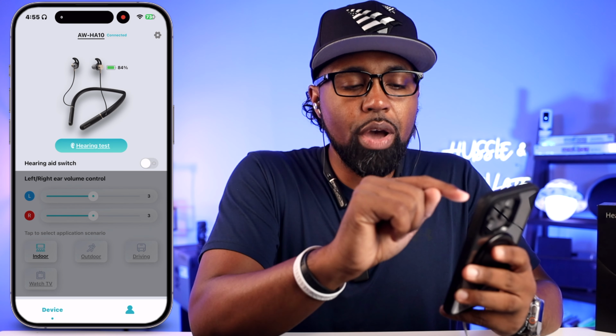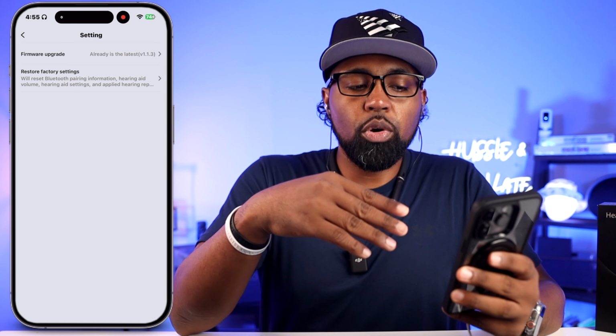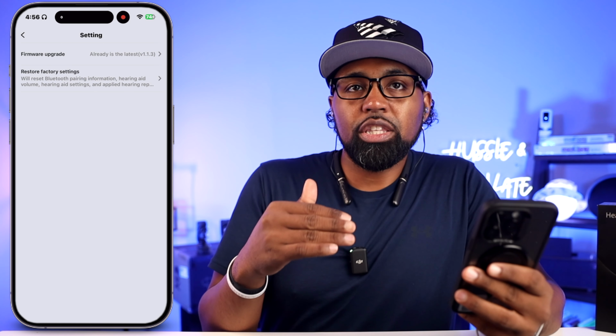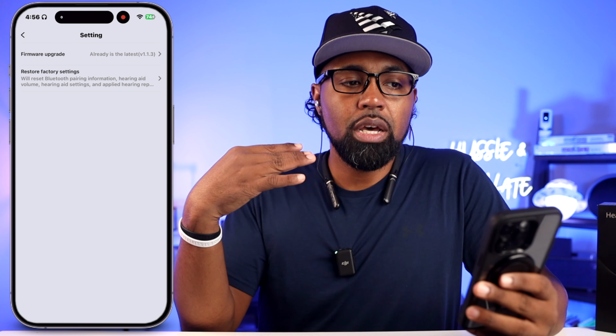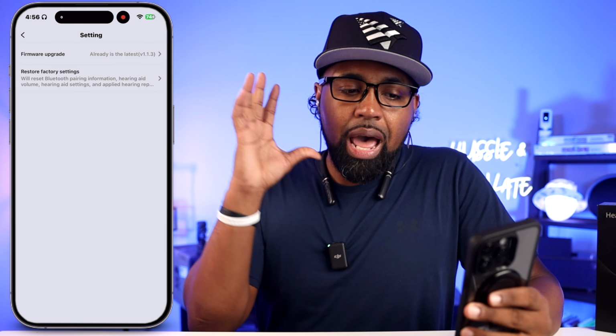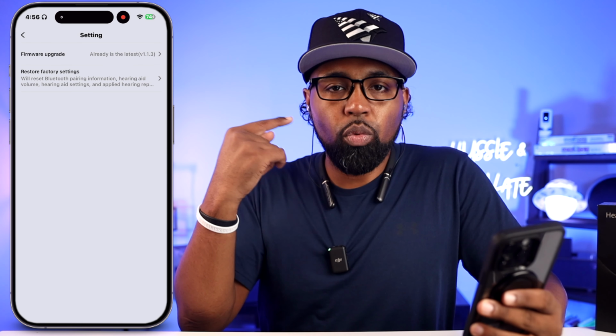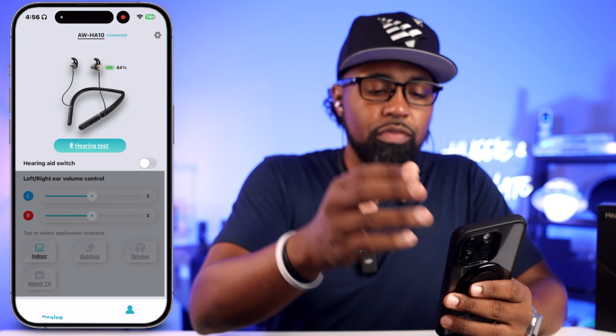As you can see at the top right, you do have your gear icon up here. It has your firmware upgrade. I do recommend as soon as you get this, you upgrade your firmware, simply because when I first put these in and they were in hearing aid mode, it was extremely loud. I upgraded the firmware and it helped out with a lot of the ambient sound coming in. It just seemed like it was working a lot better after I upgraded that.